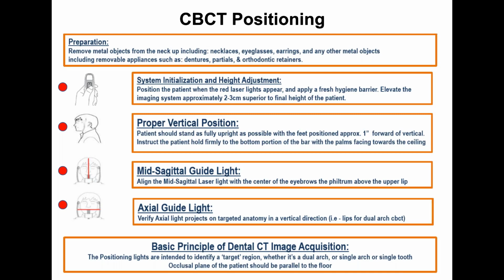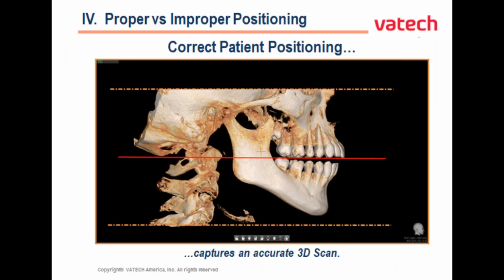That's also going to relax their shoulders down to keep them comfortable. Right. So let's look at proper positioning and what the resulting scan should look like. I think this is going to show us that flat occlusion.